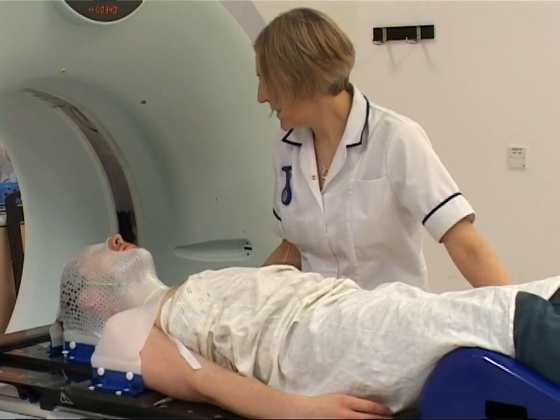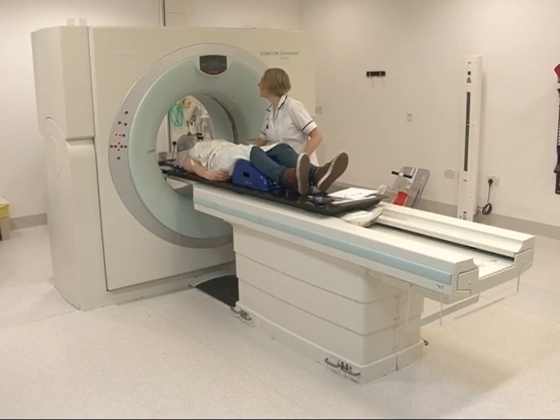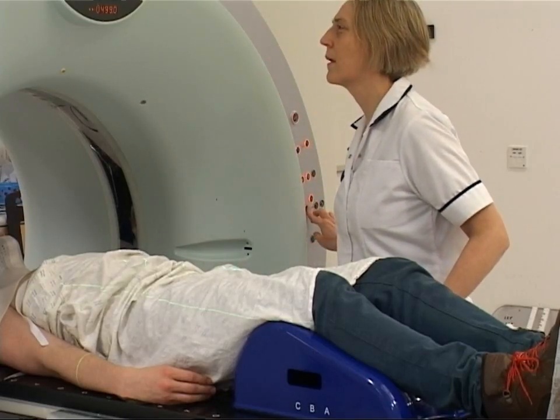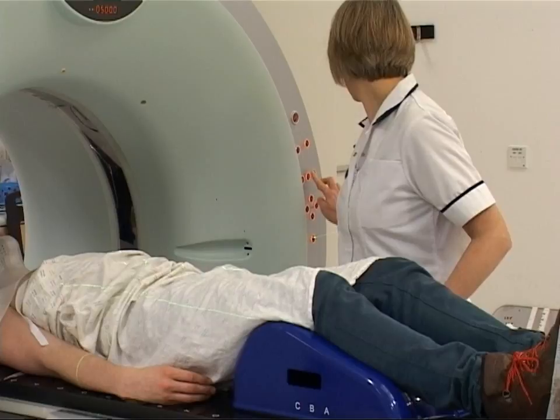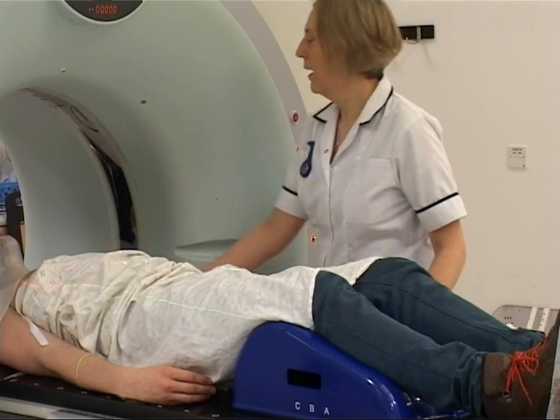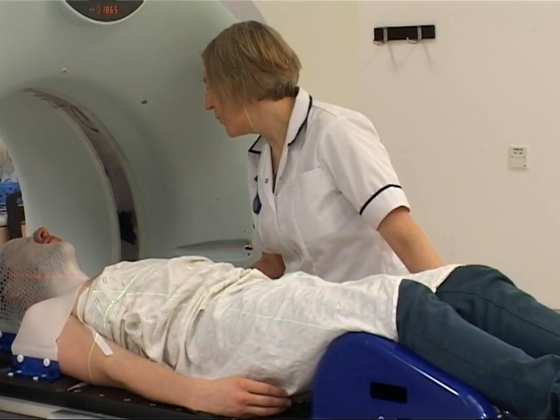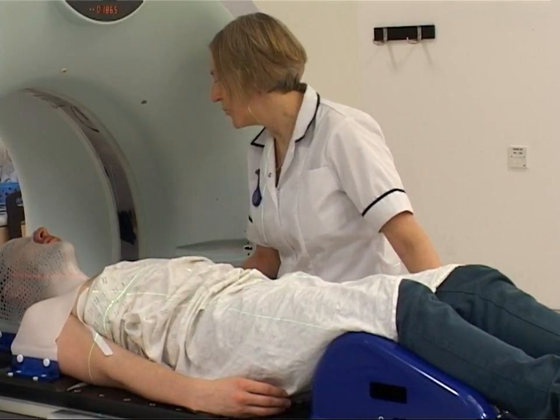Your mask may feel different when you put it back on for your planning scan — it will have gone cold and be completely rigid. Please tell the radiographers if it feels very uncomfortable or you find it hard to breathe before you have your scan, as your position may need adjusting. Just breathe away as normal, and you can raise your hand if needed.